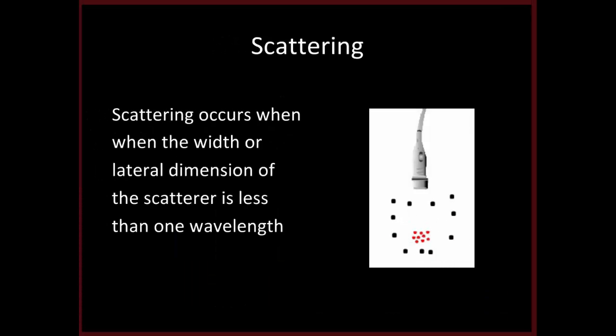Scattering is a phenomenon that occurs when the width of the lateral dimension of the scatterer is less than 1 wavelength. Scattering is actually really useful in ultrasound because scattering results in the formation of ultrasound images.